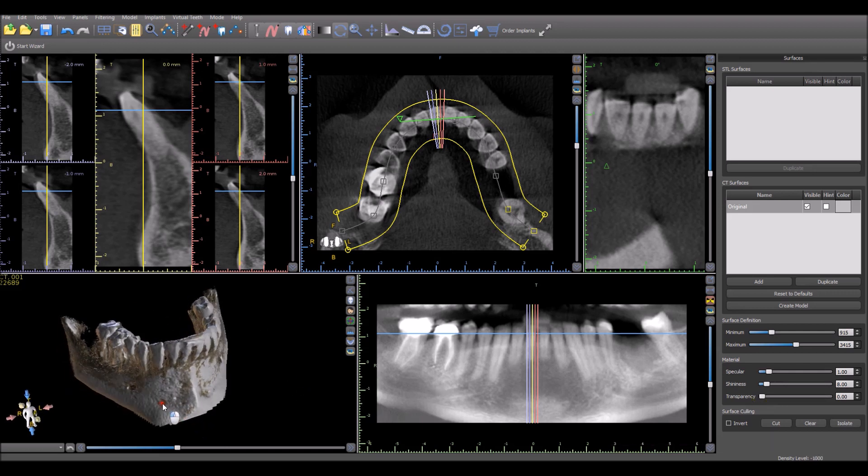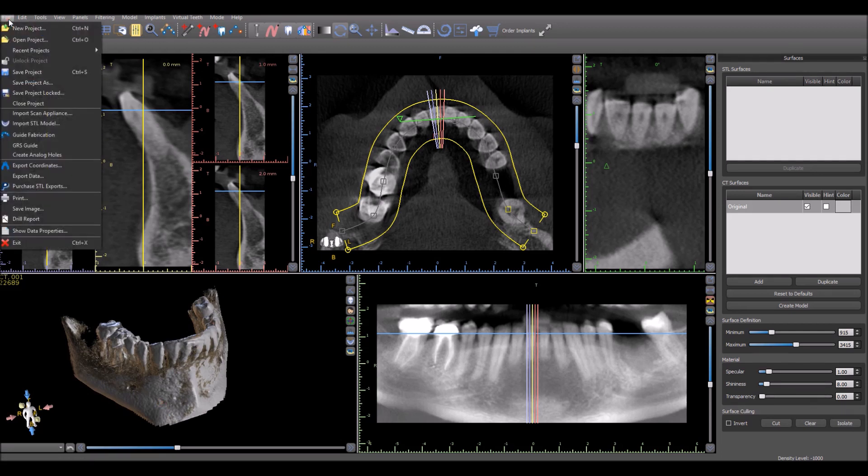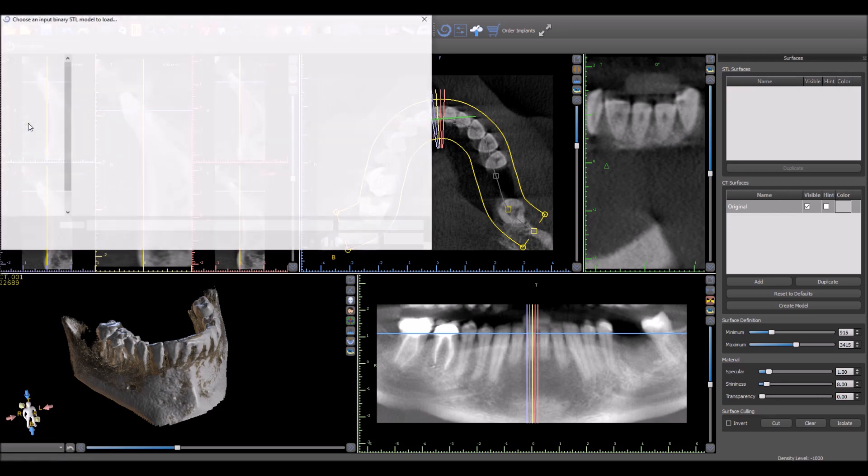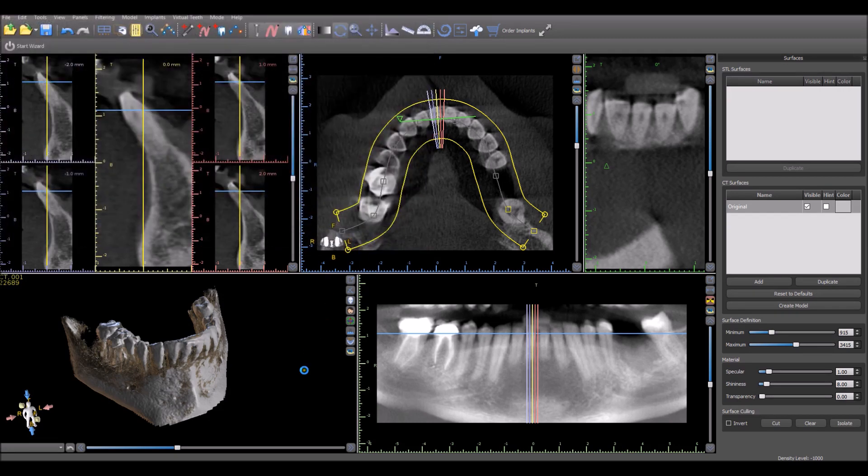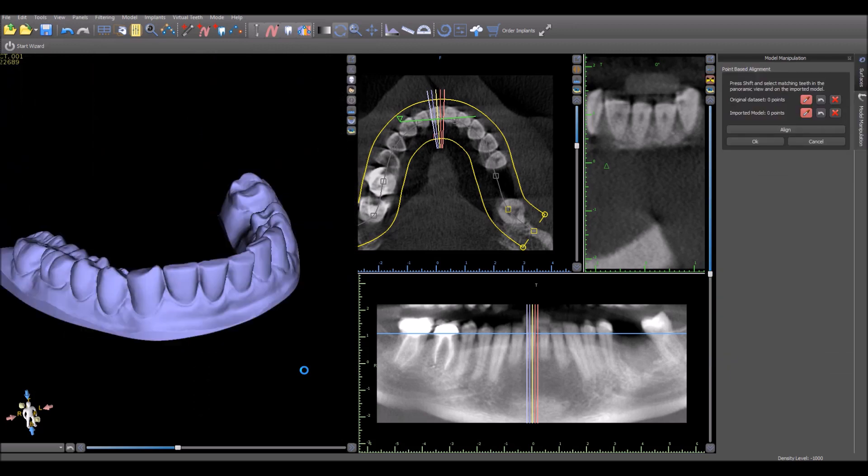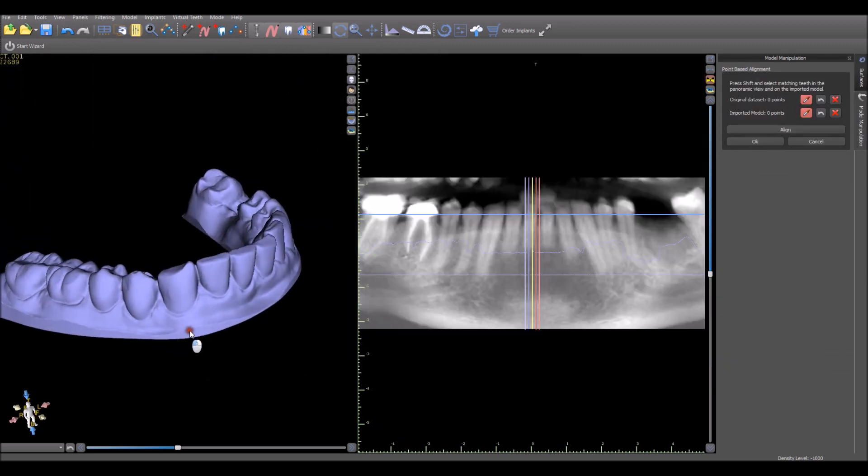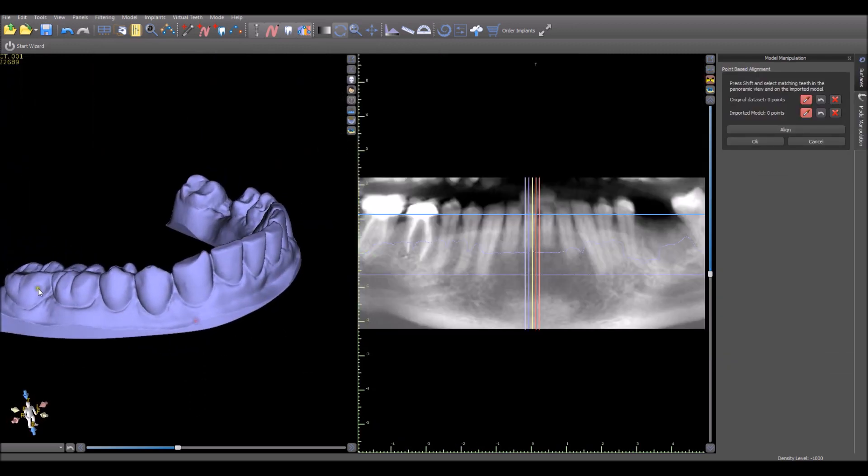Once you have the CT scan imported, you could go ahead and import the model. File, Import STL. You could select the STL model that you want to import. The model is used for guide fabrication design purposes mostly.